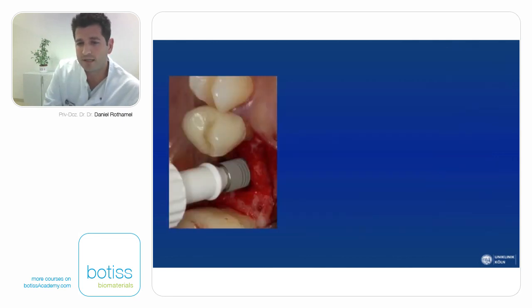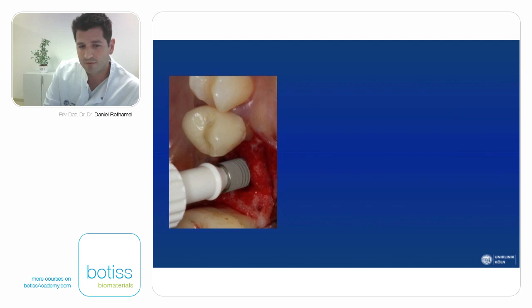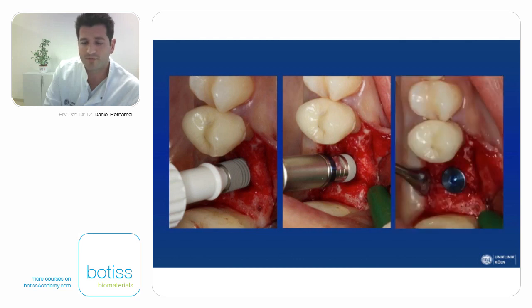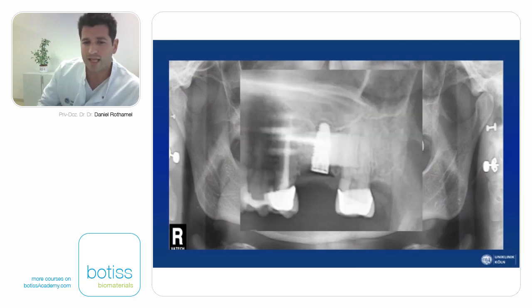Of course, what we do is that we perform the preparation of the implant cavity, and then before placing the implant, we are using some flat osteotomes, and with some hammering technique, we can expand the sinus floor a little bit more to the apical part, and then place the implant. So the idea is to use the flexibility of the bone, and we can see it quite easily on the postoperative X-ray. With these little hammering techniques, of course, the patients don't like it that much because of this intensive hammering, but you can see in this region that the flexibility of the bone had the effect that we have expanded the bone more to the apical part.